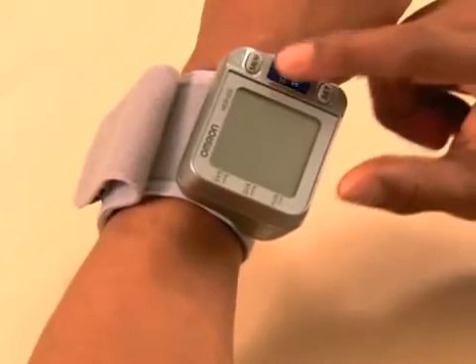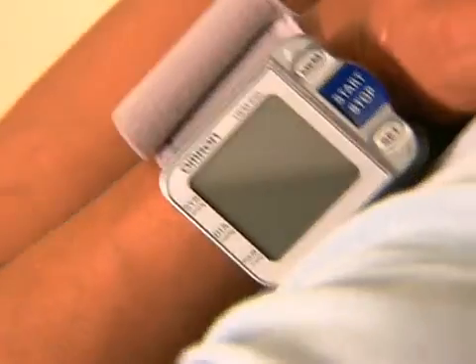To turn the unit on and take a measurement, press the start stop button once. The monitor will start beeping.